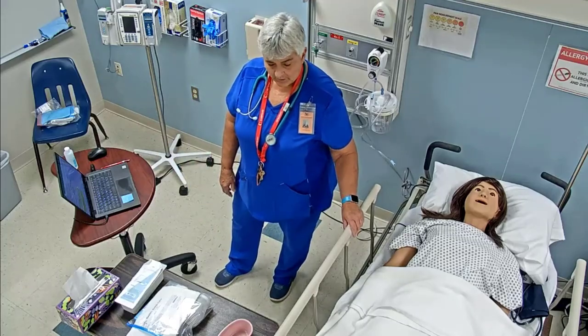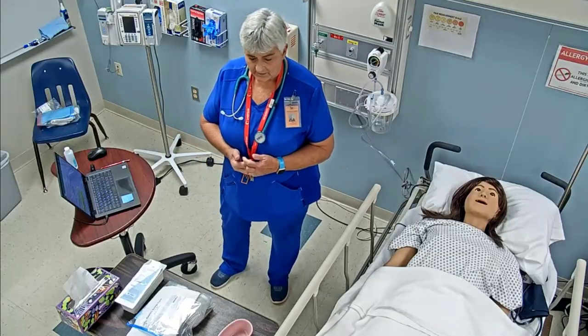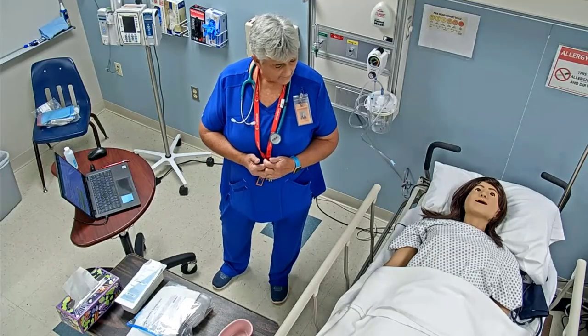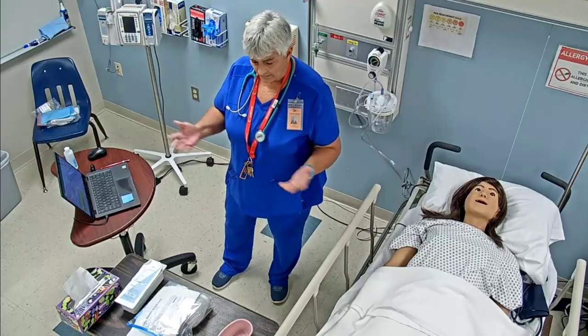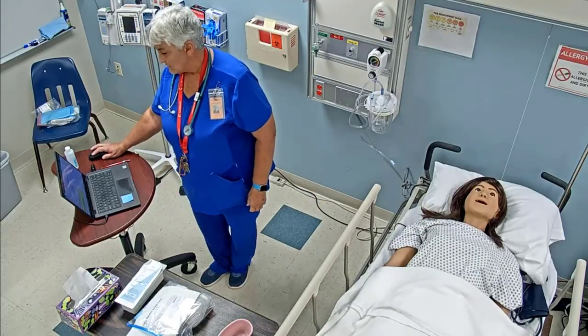Okay, today we're going to be going over how to do NG insertion and then also how to remove an NG, nasogastric tube. And so the first thing that we're going to do is go to the nurse's station.